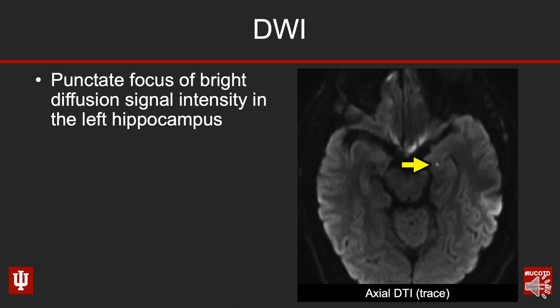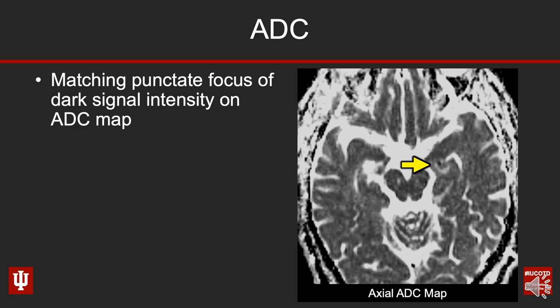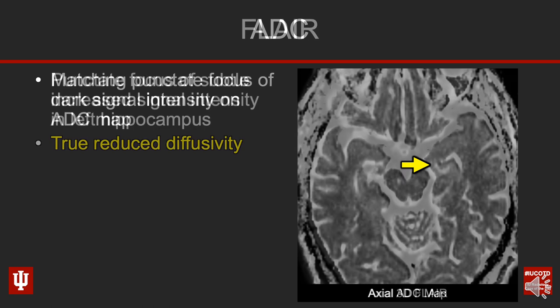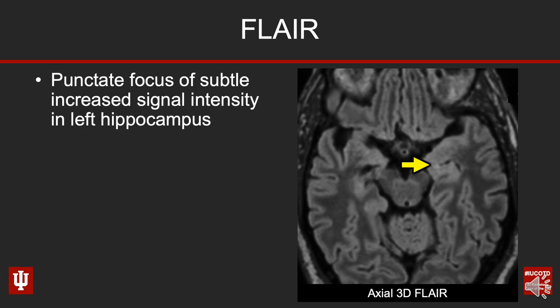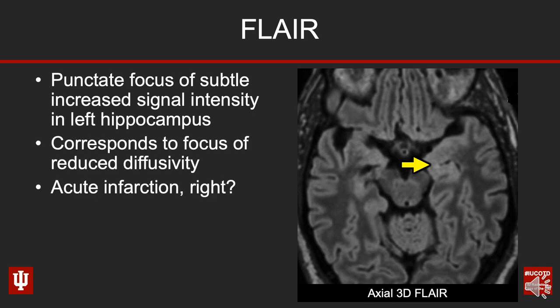Now if we look on the ADC map, we can see that there's matching punctate decreased signal intensity. So this is diffusion bright and ADC dark — this has true reduced diffusivity. And if we look on the FLAIR imaging, we can see that there's just a little tiny amount of increased FLAIR signal intensity right here at the tip of the yellow arrow, corresponding with the area of reduced diffusivity.